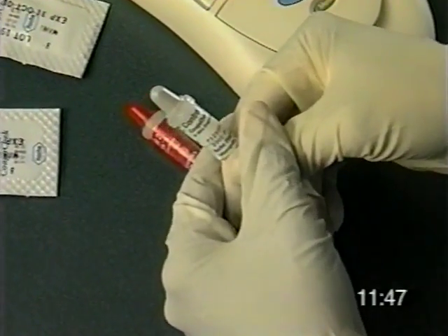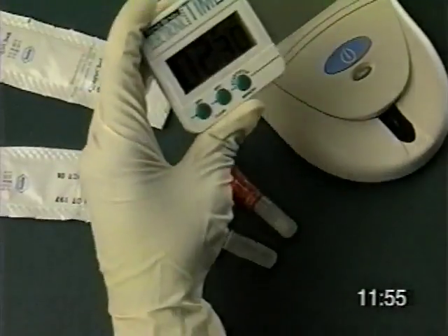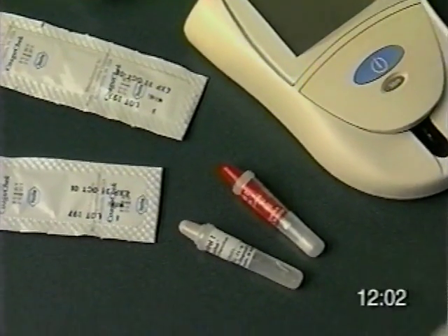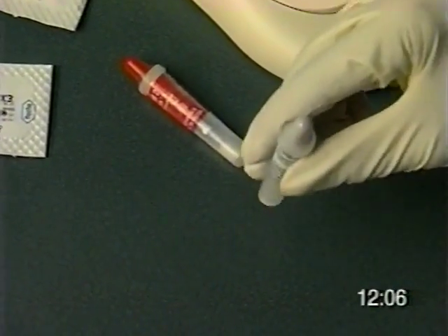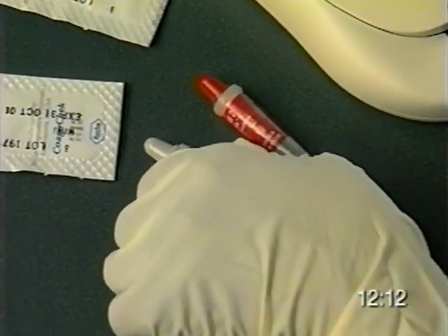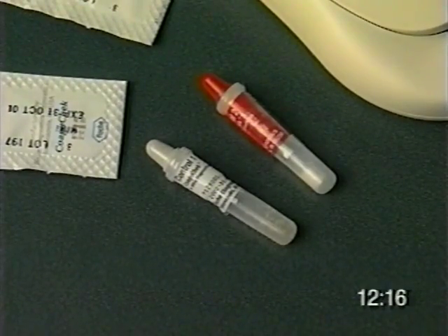I can feel it break, and it makes a snapping sound. It's important to make sure you squeeze. You shouldn't bend the vial. Now I start my timer for 2.5 minutes, and then tap the control 10 times to mix it. Then I lay the control on the table for the remainder of the 2.5 minutes and get a test strip pouch.